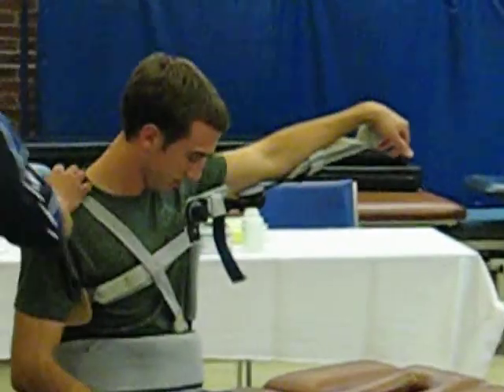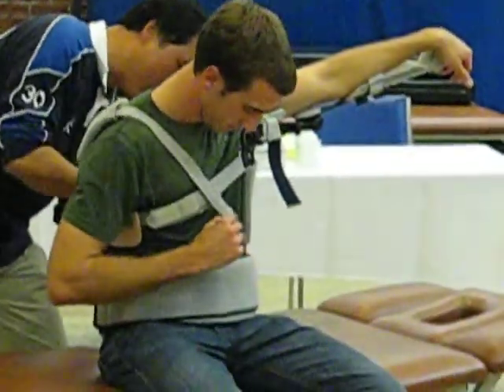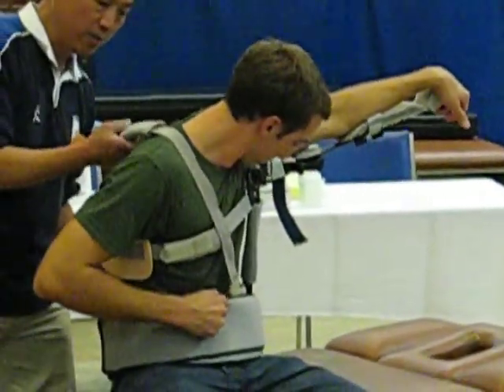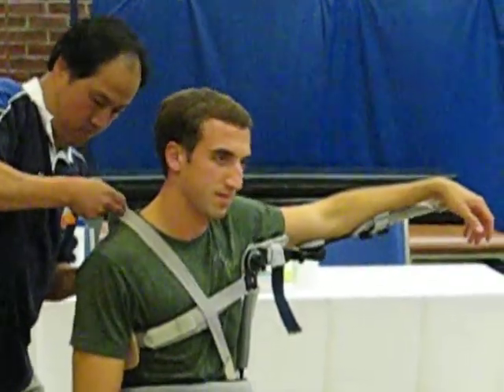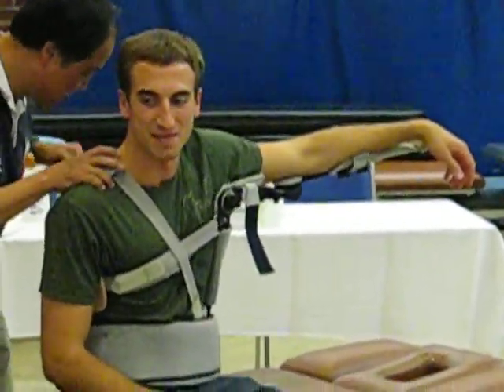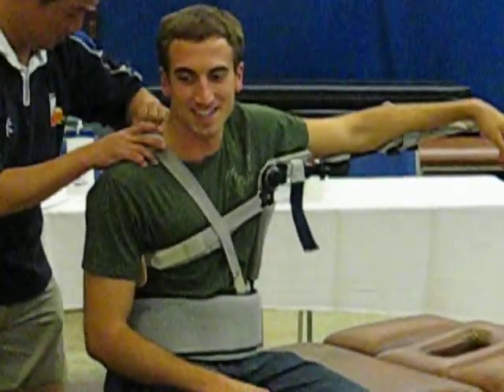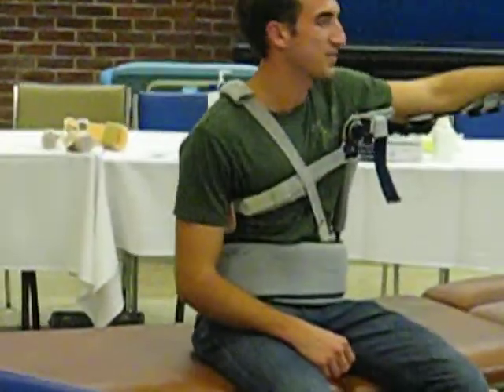And then we have to make sure the splint is well positioned and well supported by the body. It's comfortable. Okay. Let's say we have the body frame well supported.